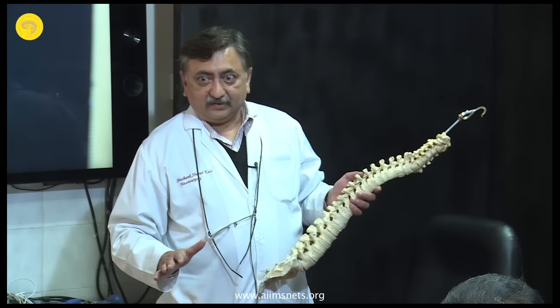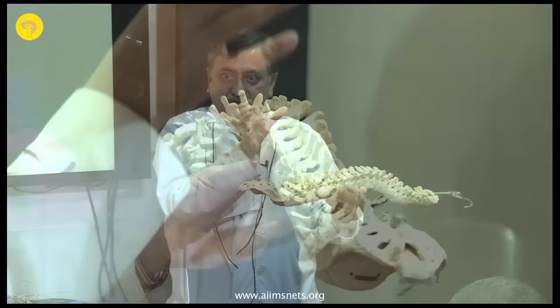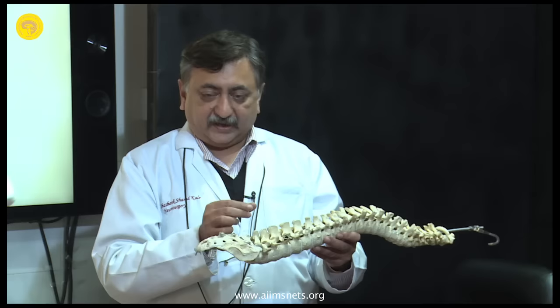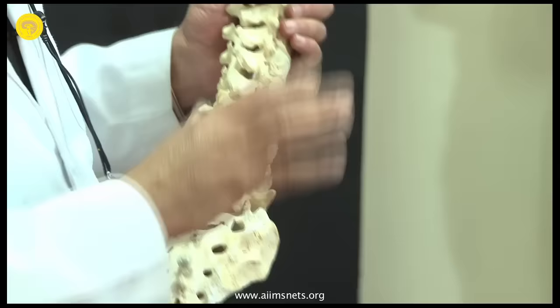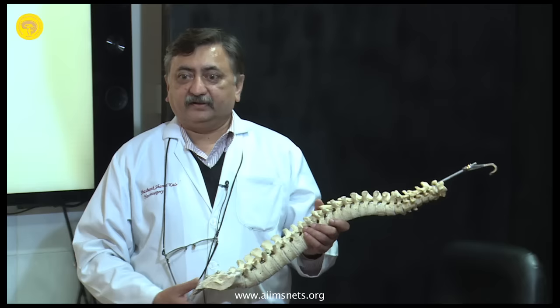And the vertical angle, the best thing is to have an intraoperative x-ray, when the patient is like this, and see that you are in the middle of the pedicle, neither too close to the foramen above nor too close to the foramen below. You should be in the cancellous bone in the pedicle, because there is a small cancellous bone element in the pedicle, most of it is cortical bone. So as long as you are in the middle of the pedicle, angled medially and starting at the right point, you will go nowhere but the pedicle, unless there is a distorted anatomy or a tumor which has eaten away the pedicle or something like that.